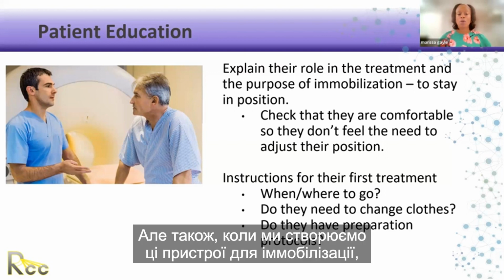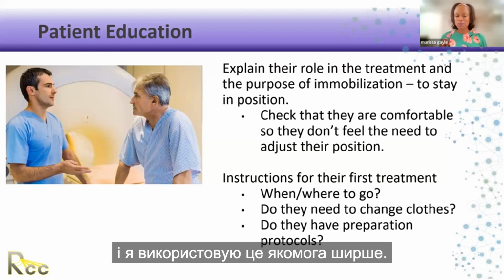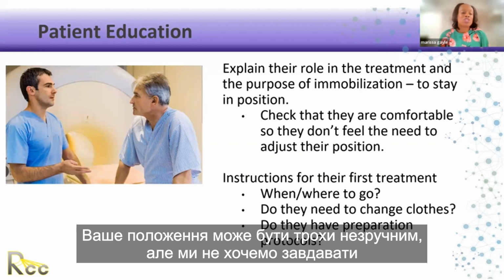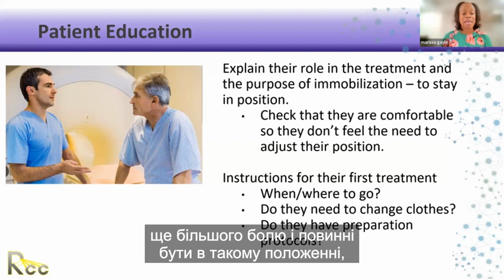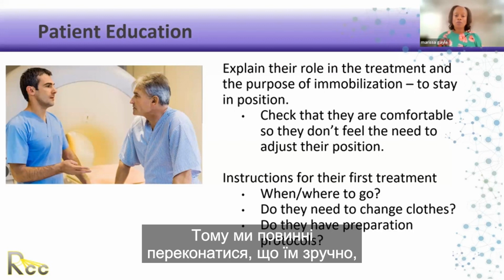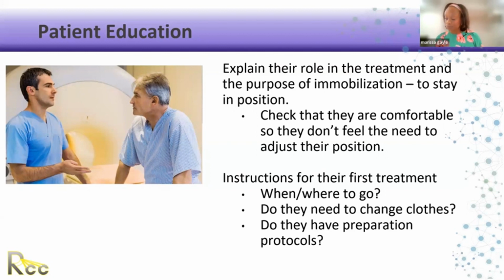But also when we are creating these immobilization devices, you want them to be as comfortable, and I use that loosely, as possible. Yes, the table is hard, and your positioning may be a little awkward, but we do not want to be causing greater pain, and it has to be a position that they're going to be willing and able to hold still for about 30 minutes. So we need to check that they are comfortable so they don't feel the need to constantly adjust positions.